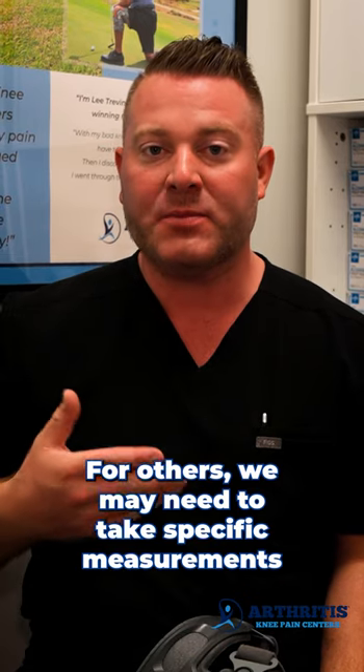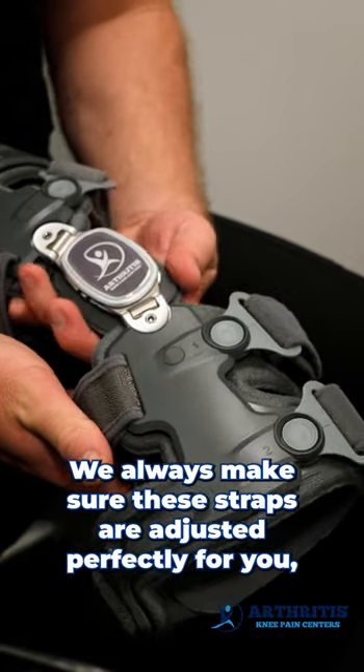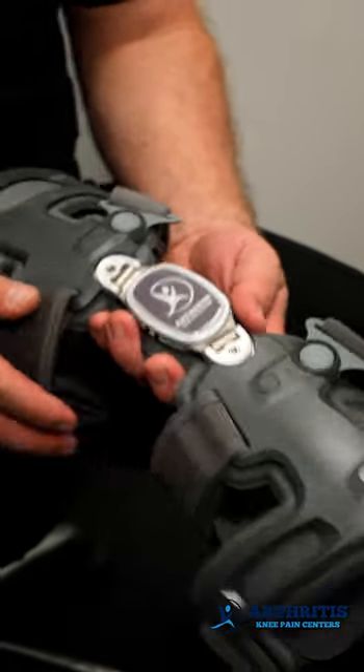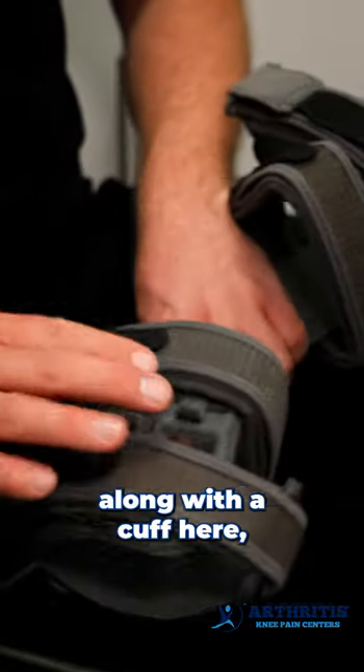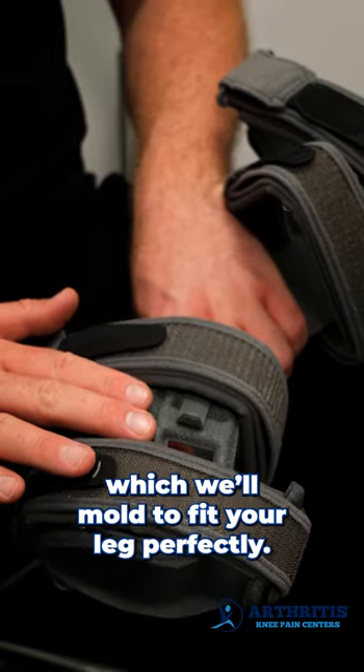For others, we may need to take specific measurements to make a brace with that perfect custom fit. We always make sure these straps are adjusted perfectly for you, along with a cuff here, which will mold to fit your leg perfectly.